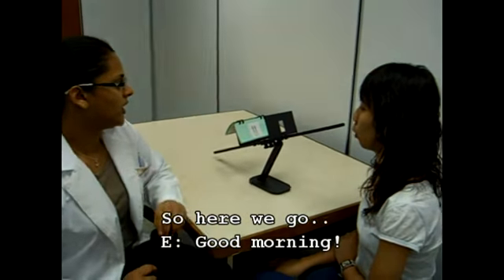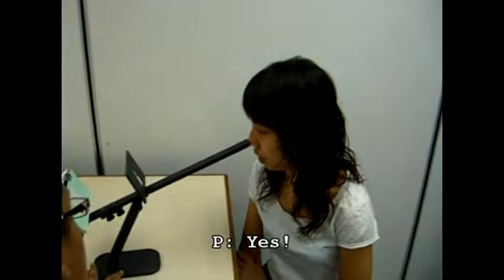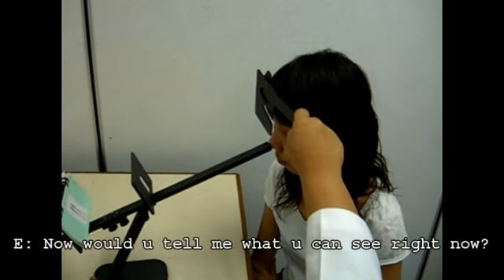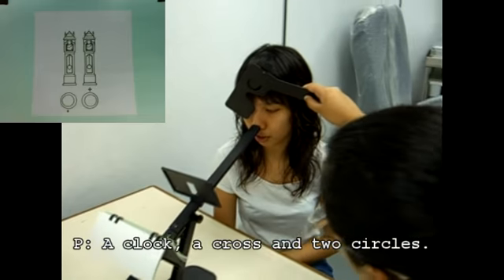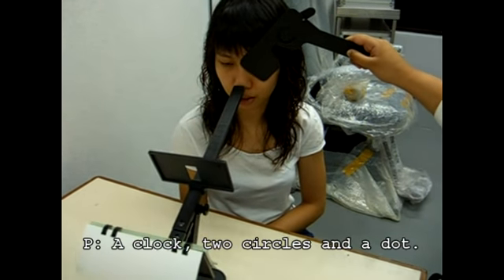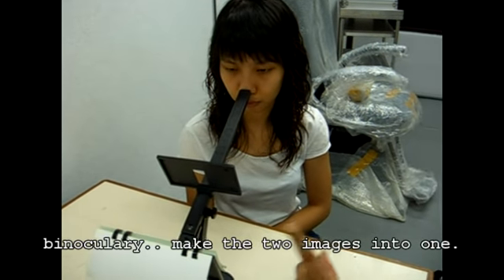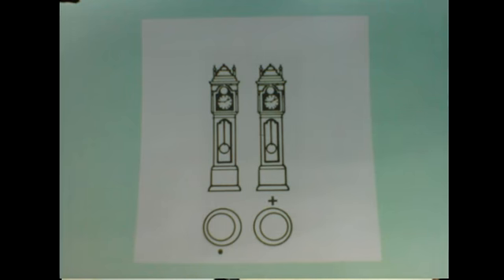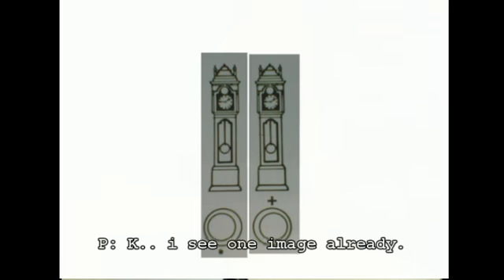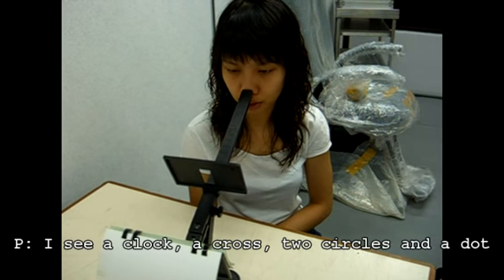So here we go. Good morning. I'm going to ask you to put the tip of your nose here. And you see two images, right? Yes. Now you tell me what you can see right now. A clock, a cross, and 2 circles. And what about now? A clock, 2 circles, and a dot. Now I'm going to ask you to binocularly make the two images into one. Okay, I see one image already. I see a clock, a cross, 2 circles, and a dot.